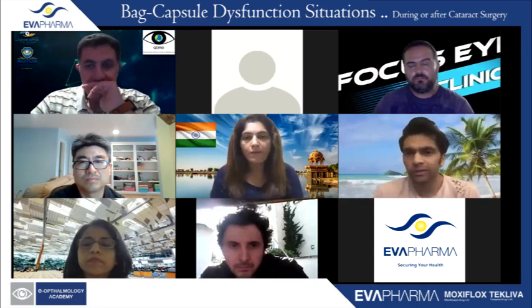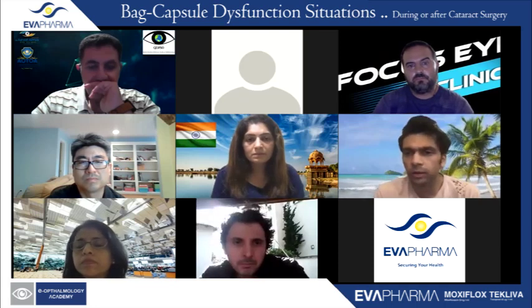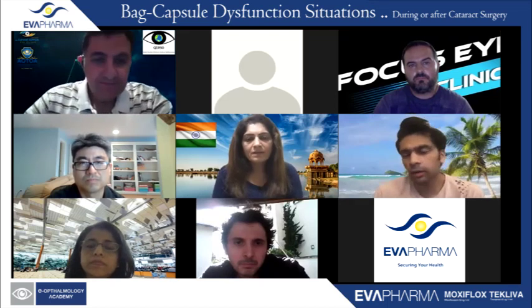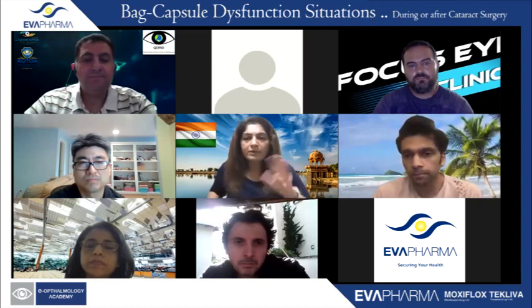Personally, I use the same procedure, but I don't change the IOL power at all. Honestly, I have not changed my IOL, and it comes out to be perfectly fine. Some people do it by 0.5 diopters.